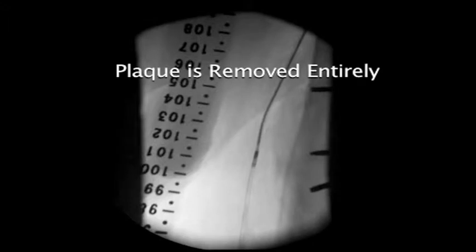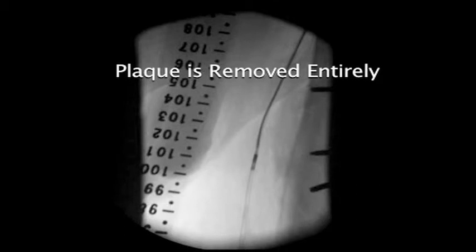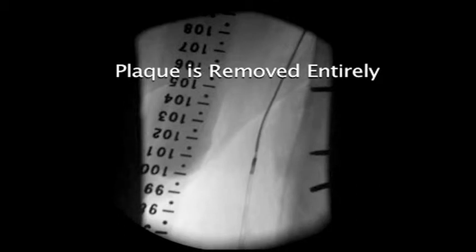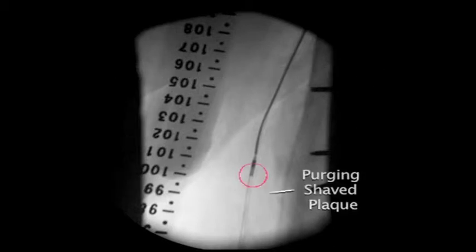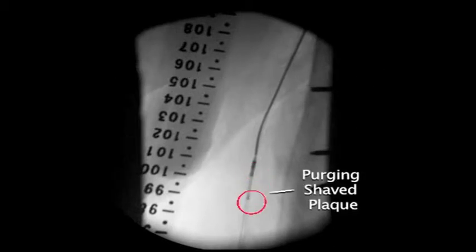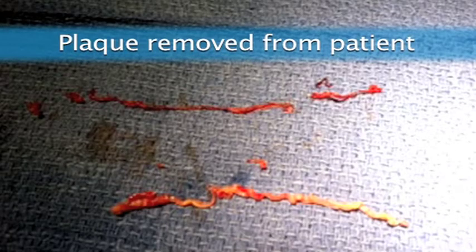Unlike angioplasty procedures that push plaque into the artery walls, the atherectomy device removes plaque from the body entirely, periodically purging the shaved plaque from the rotating head of the device into an attached storage container. When the container is filled, the device is removed from the body to be emptied.